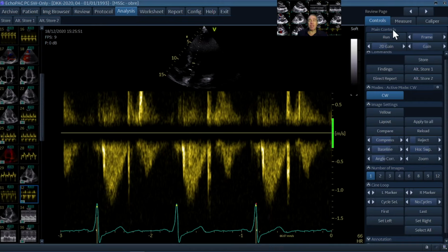With a continuous wave you measure all across the line, and along this way, you have a maximum velocity which is like here below 1.5 meters per second, which is close to 1 meter per second. So you have normal velocities. You know pretty sure that there is no pathologic flow acceleration on this way. So no significant hemodynamic stenosis of, for example, here the aortic valve.